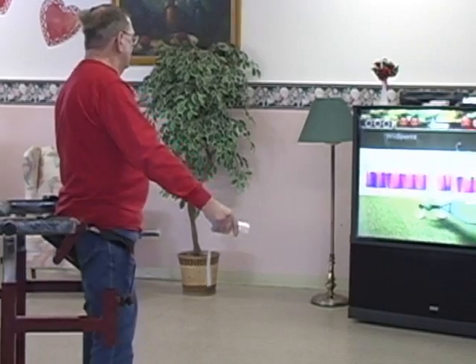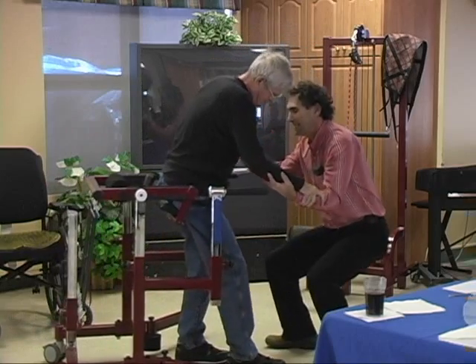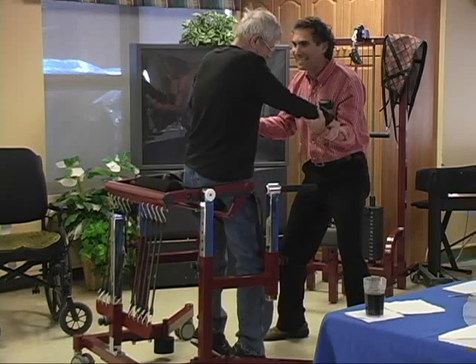The patient in that report could stand safely. Can you imagine how many potential stories like that could be written for people who are not able to train on their feet, but who would be able to do so with this new and exciting enabler of mobility, the Bungie Mobility Trainer.